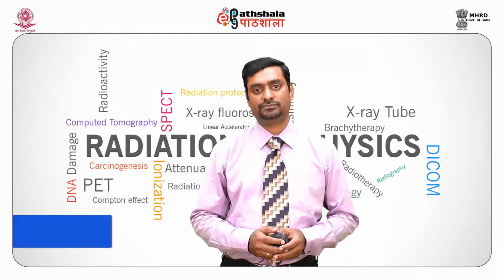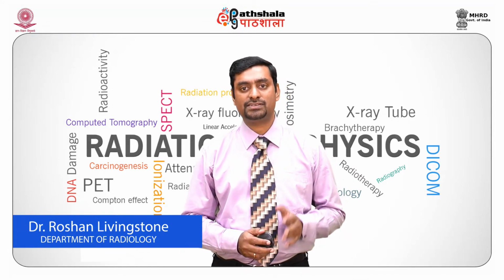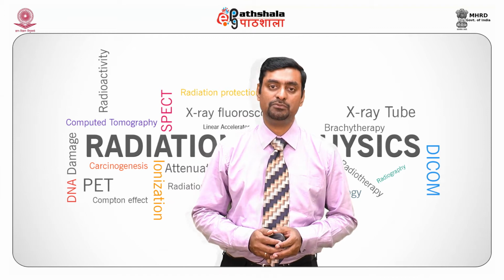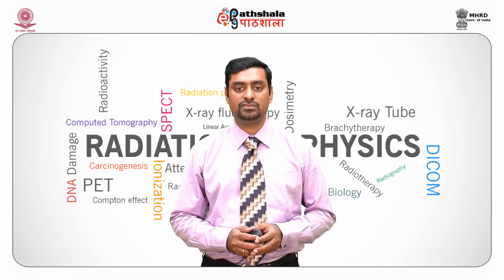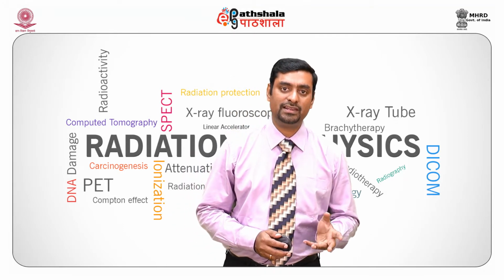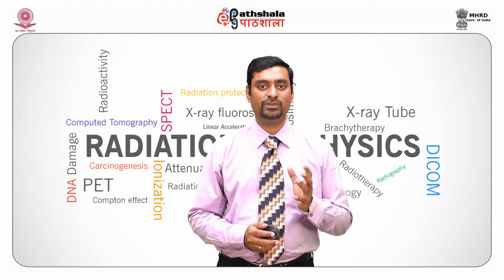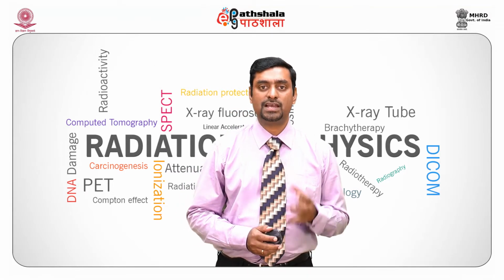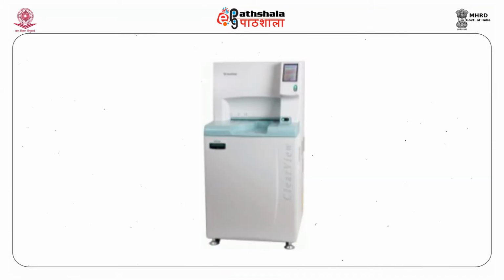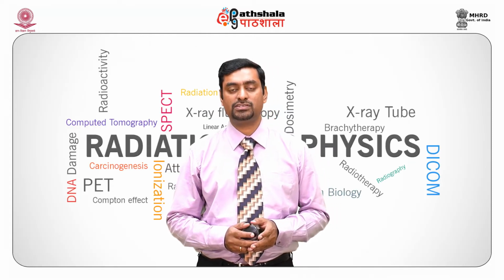In a CR cassette, incident X-ray photons interacting with the phosphor create electrons which are trapped in the phosphor material to form a latent image. The CR reader uses a laser which stimulates the trapped electrons to fall to a ground state by releasing energy in the form of light. The light that is emitted is blue in color. That blue light emitted from the phosphor screen is absorbed by a photomultiplier tube which converts light into an electrical signal. This signal is then amplified and processed to be displayed on a monitor.